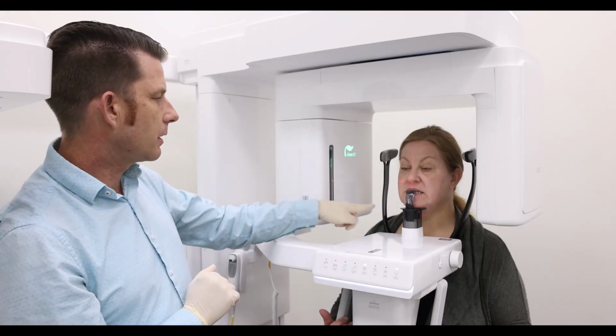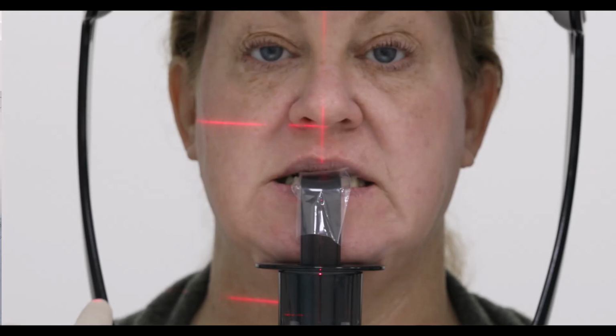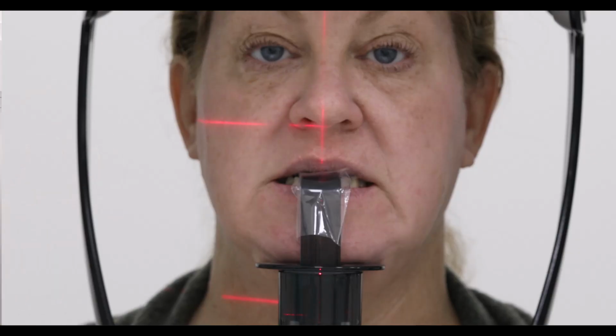You'll also notice the lower horizontal beam, which shines on the patient's neck. That is shining off the base of the X-ray tube, which denotes the rotation. This will give us a way to see if the overhead will be bumping their shoulders.